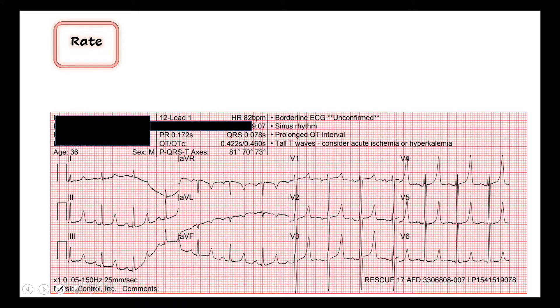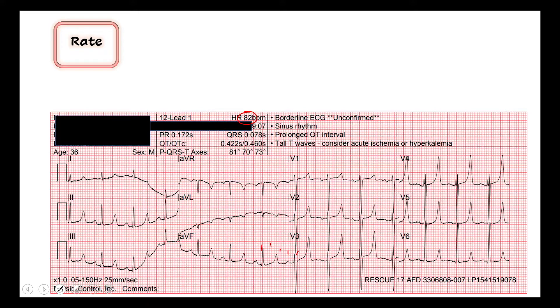We read this one just like we always do, same way every time so that we don't miss anything. Starting with our rate — the computer says we have a rate of 82. Let's find a QRS that matches up with one of the thick red lines and count down: 300, 150, 100, 75. So somewhere between 75 and 100 to the next QRS complex. 82 fits right in with that, so we'll agree with the computer. He has a rate of 82, which is normal and reassuring.